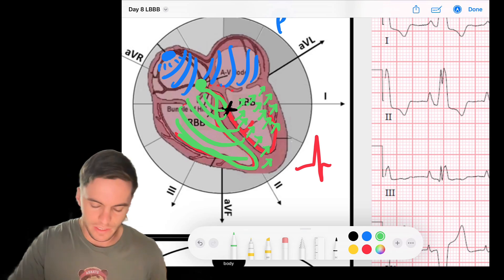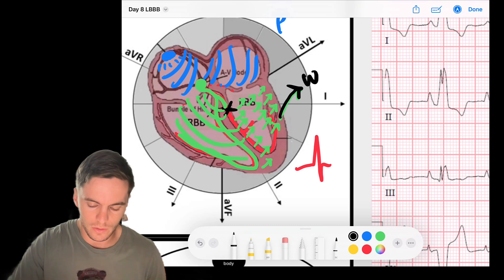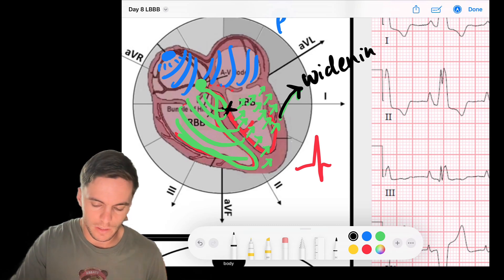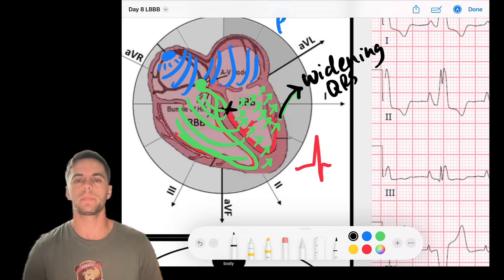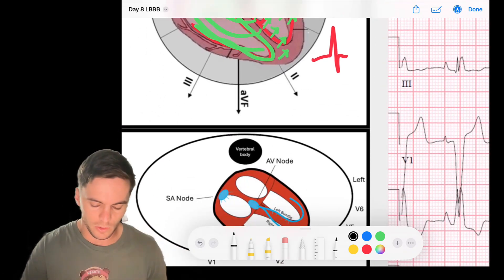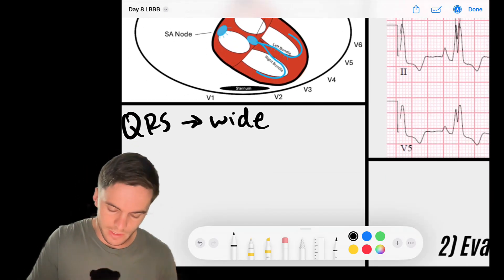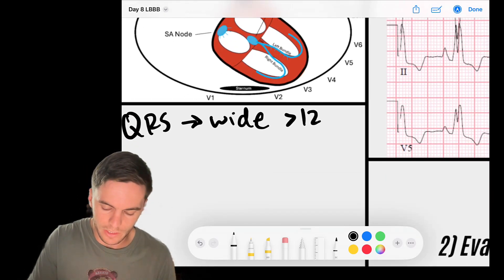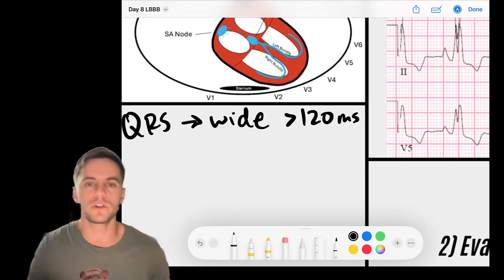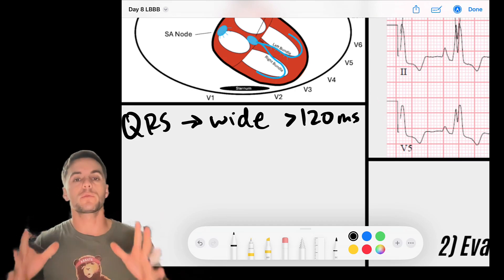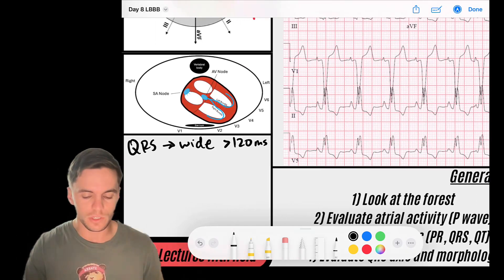And so that is the cause of the widening of the QRS complex. So that's the first criteria. Our QRS is going to be wide. And remember that the wide QRS is greater than 120 milliseconds, or three small boxes.